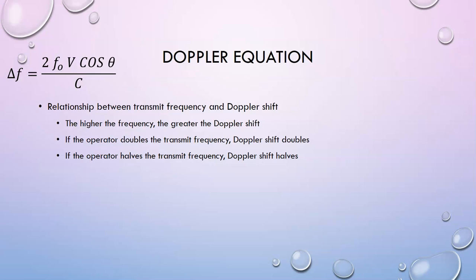The relationship between the transmit frequency and the Doppler shift: the higher the frequency, the greater the Doppler shift. If you double the frequency, you double your Doppler shift. It's that simple. If you halve the frequency, you halve the Doppler shift.